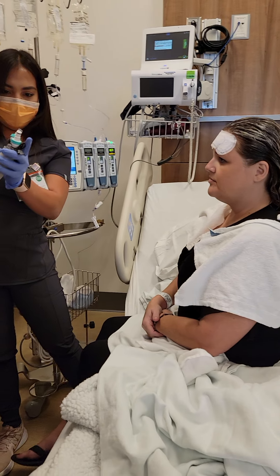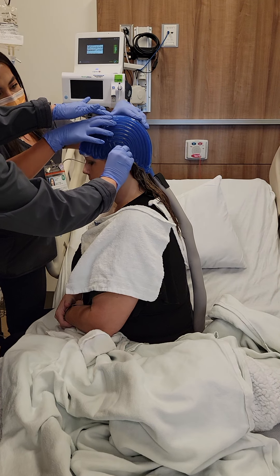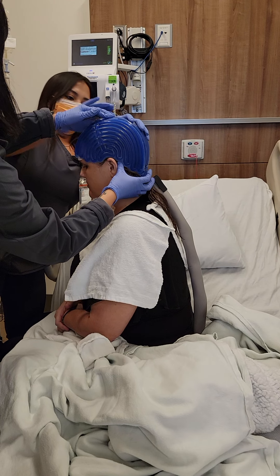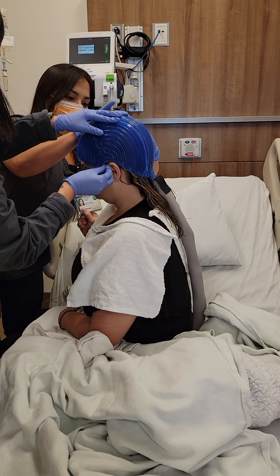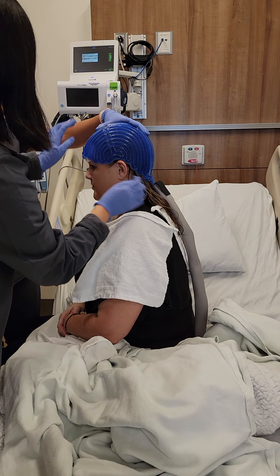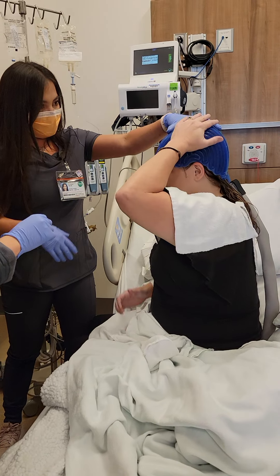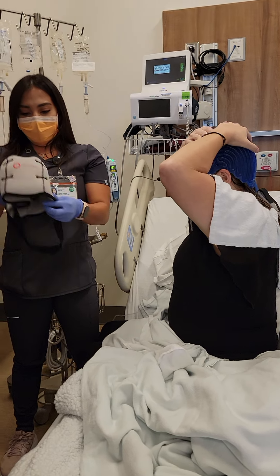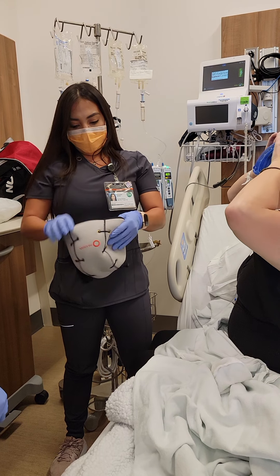That's where we're going to put the blue cap — make sure you have your token. Get all the hairs tucked in on the side. The headband doesn't even put pressure on your ears. Then make sure everything here is loose. I have already loosened it up. Then this one too, and then you flip it inside out.